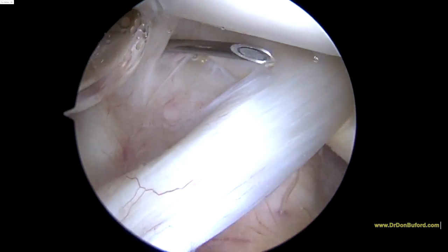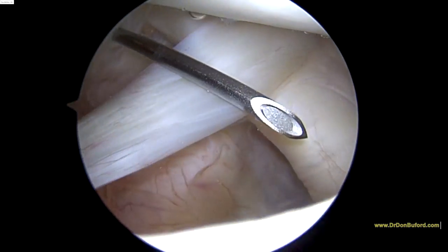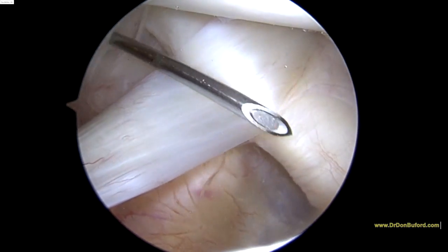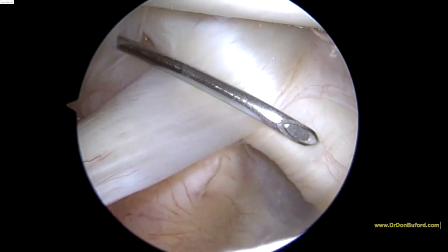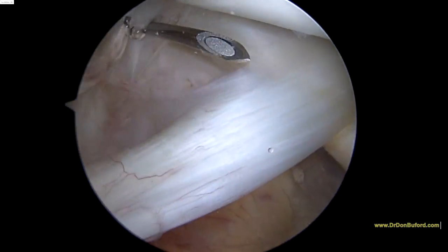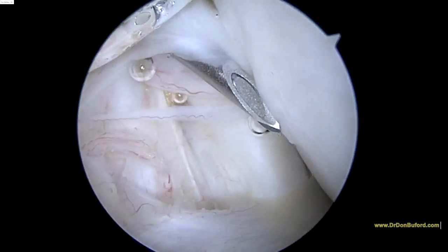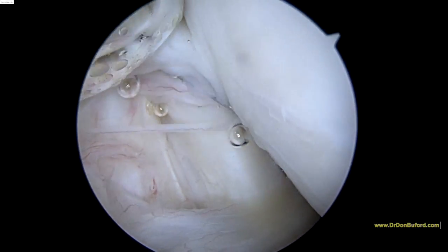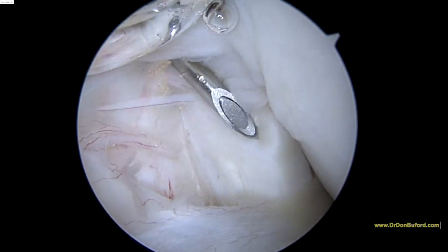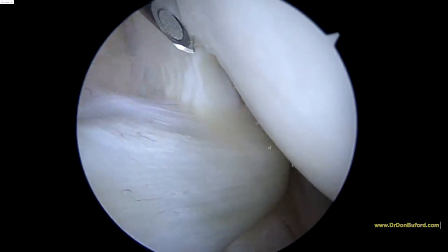Behind it is the much more substantial superior edge of the subscapularis tendon. So this that I'm touching with the tip of the needle — that's the subscapularis. You can see how it runs at an angle and it inserts up at the top here into the lesser tuberosity of the proximal humerus.